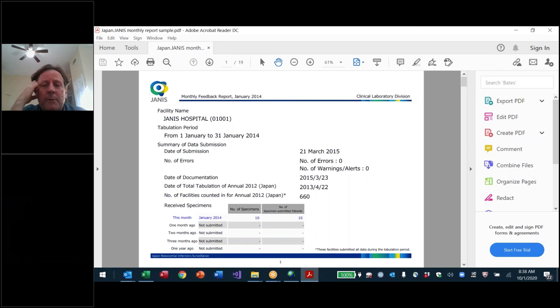So now when they're going up to 40 hospitals, they're going to keep the 9 sentinel sites continuing with a special protocol. But for the other 30 hospitals, they're just going to have them do normal WHONET, normal data entry, not all of this additional work. And they're finding problems that people are not measuring zone diameters. They're not doing standardized testing. So there's a lot of capacity building.